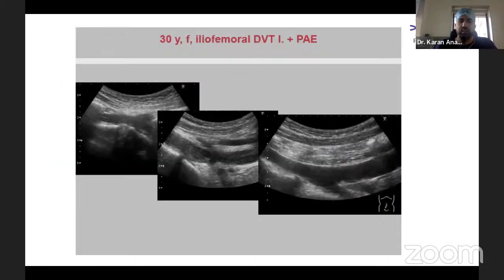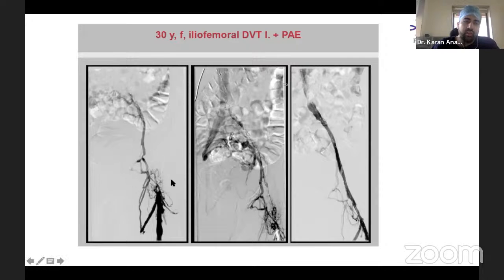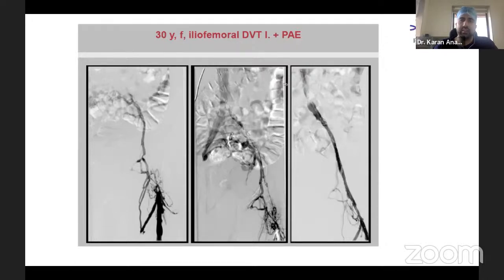Case one: a 30-year-old female with acute iliofemoral DVT. Ultrasound shows the entire vein completely filled with echogenic thrombus. The pre-procedure venogram shows no contrast reaching the iliacs or IVC, with multiple collaterals formed. After crossing the lesions with a catheter, catheter-directed thrombolysis was performed for 12 hours, resulting in good vein opening. Manual suction aspiration of residual clot was also performed, giving a good final result.